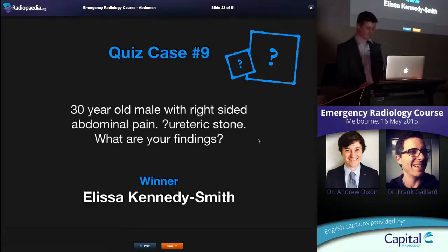I said with CTPAs earlier, I thought it's a good idea for ED doctors, ED staff, to be able to trace the vessels, find the PE, because it's a single job, single task. Same with renal colic, renal stone, or ureteric stone. One task. I think they've got this.